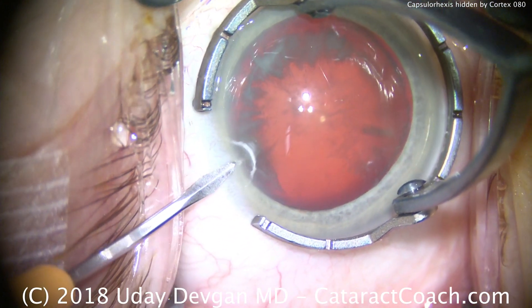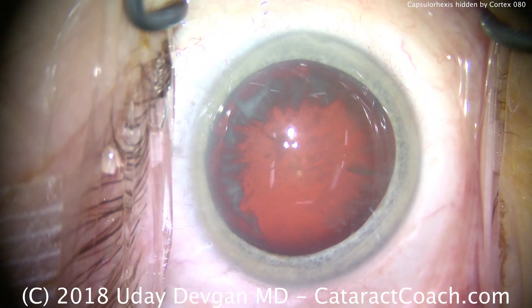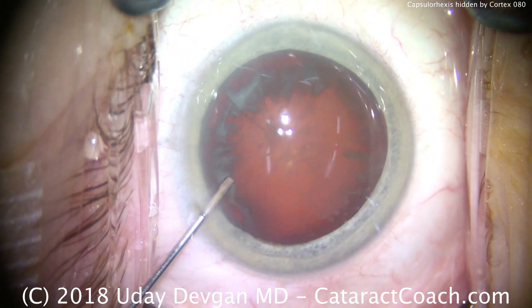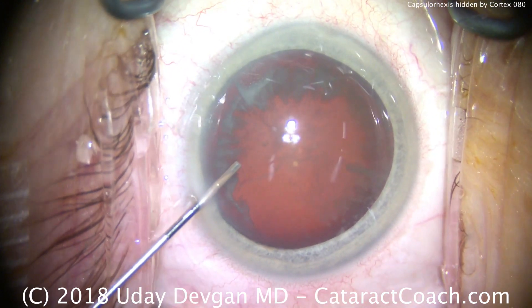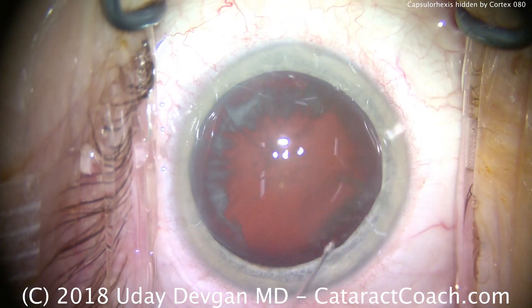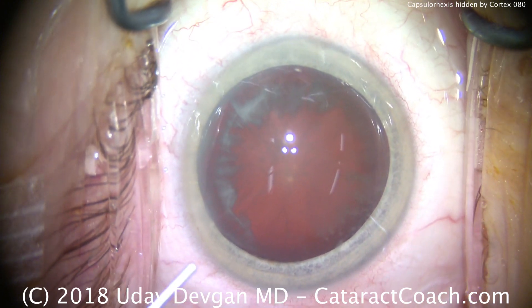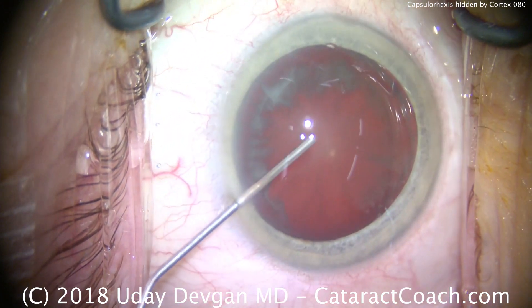CataractCoach.com presents an interesting case. It is a routine cataract, but one thing that's different is the pattern of the lens cortical opacities. From about the 7 o'clock to about the 12 o'clock position, the cortical opacities are blocking just about the position where our capsulorhexis will go. So how do we deal with this?